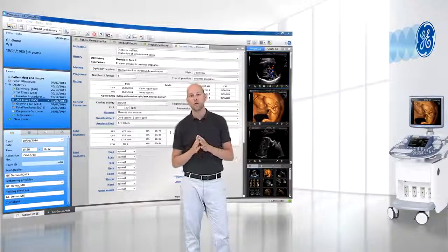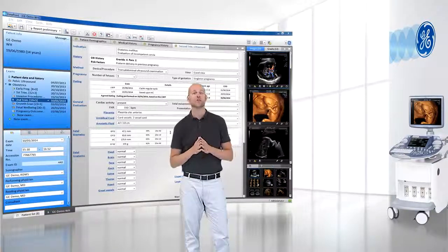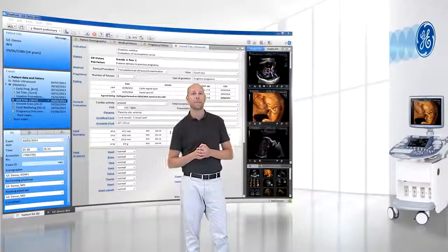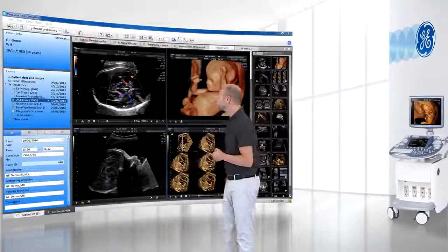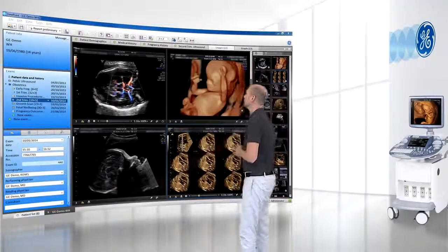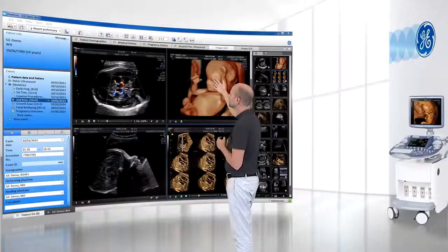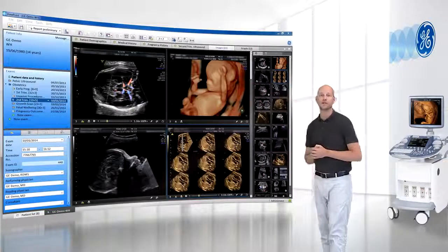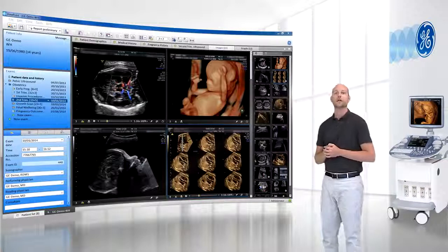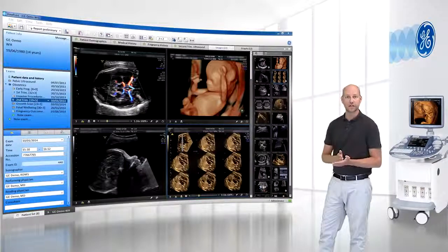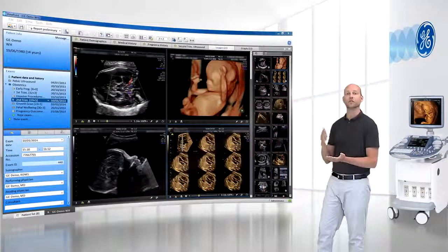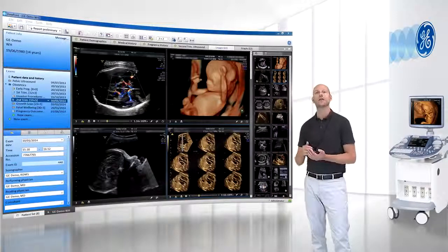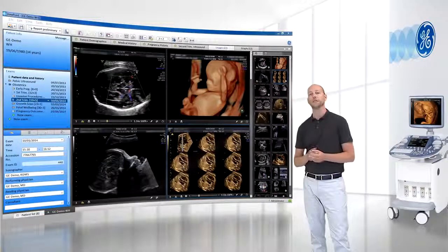Do you feel like you have all your images securely stored and available to you where and when you need them? With the Viewpoint Image Viewer, you have all your images, clips, and volumes available to view in a customizable interface, giving you the possibility to use tools such as measuring images, annotating, as well as exporting anonymized images.